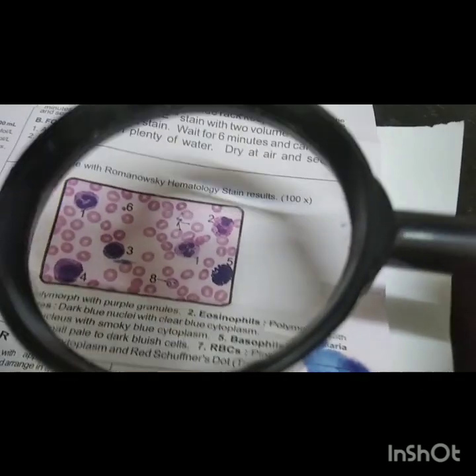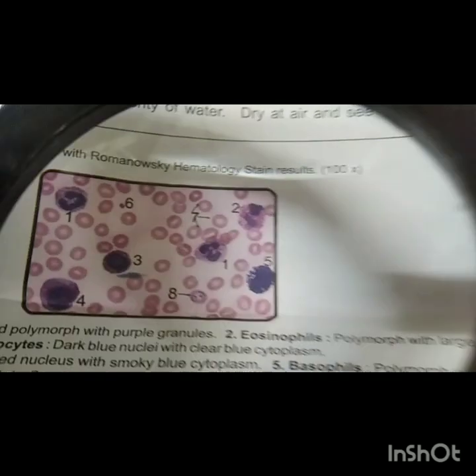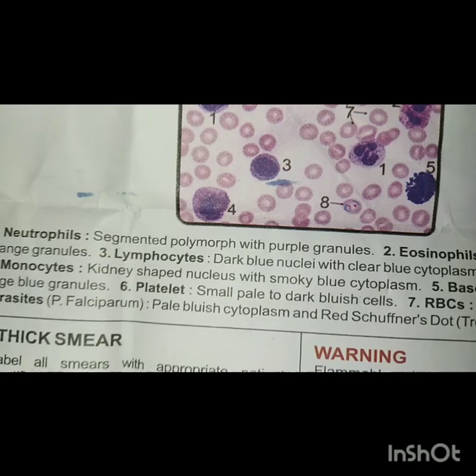Under oil immersion it looks like that. You can see RBCs, eosinophils, basophils, neutrophils, monocytes, and band cells — everything is counted in a total of 100.